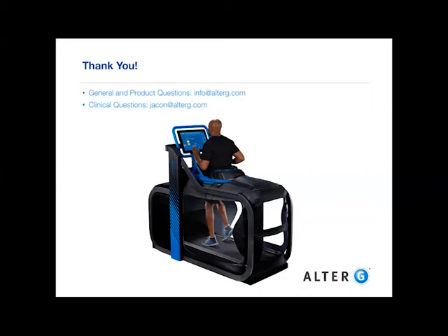But in general, there is a height restriction because if their lower extremities are too long and they actually want to run, then when they're in the back portion of their swing, at terminal stance, when they're about to perform swing through, they could hit the back of the bag if their legs are too long.